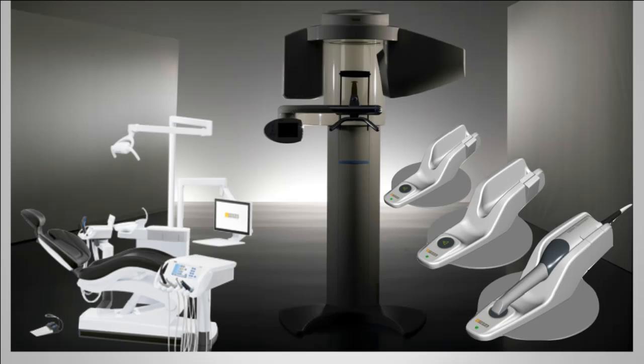My hope and my dream is to leave a butterfly effect with everybody, and I hope that this butterfly effect is something that allows all the clinicians that are logging in to see how unique implant dentistry certainly can be. And so with that said, I'm going to give you some insight into some of the technology that I have integrated into my practice. Two of the main staples are CAD/CAM and cone beam.